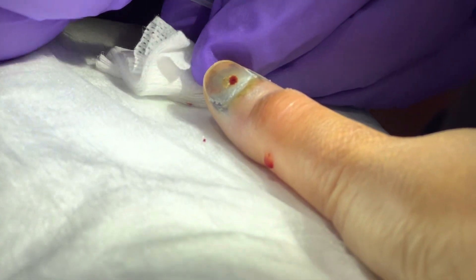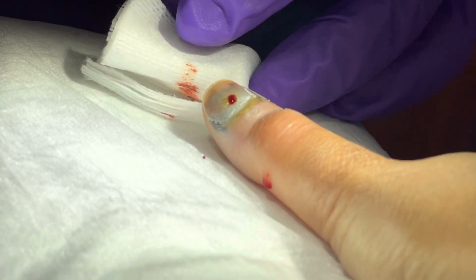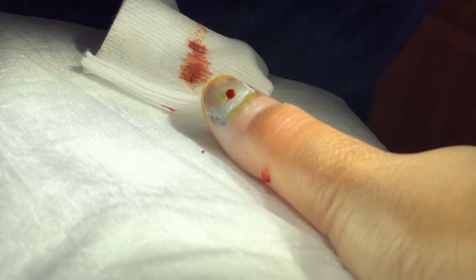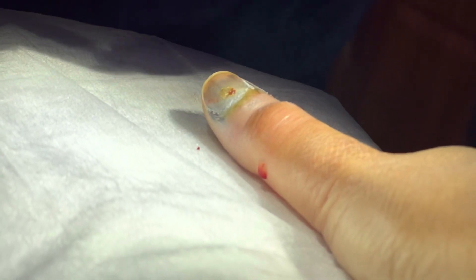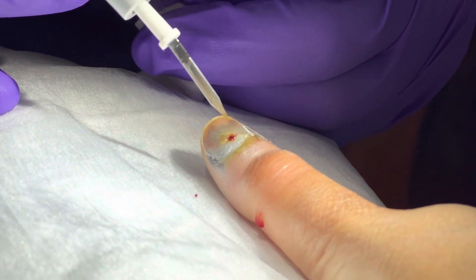Is that pus on the top? No, I think that's just broken down blood or metabolized blood, so it looks discolored. Kind of like when you get hit in the eye or something.